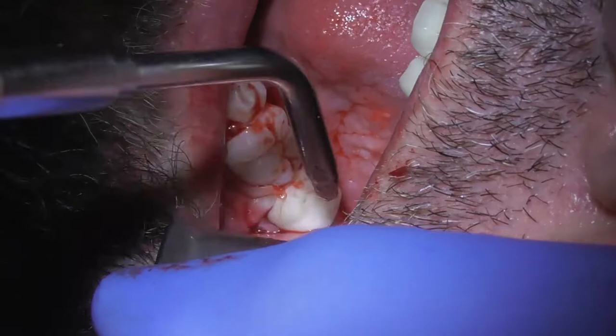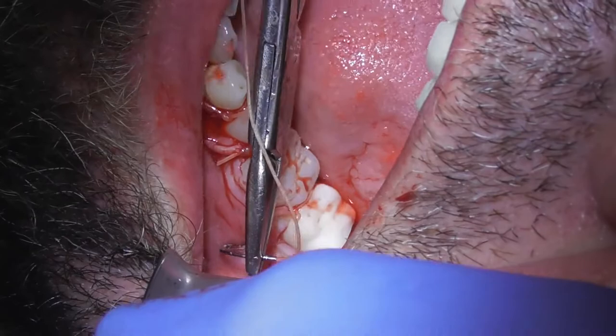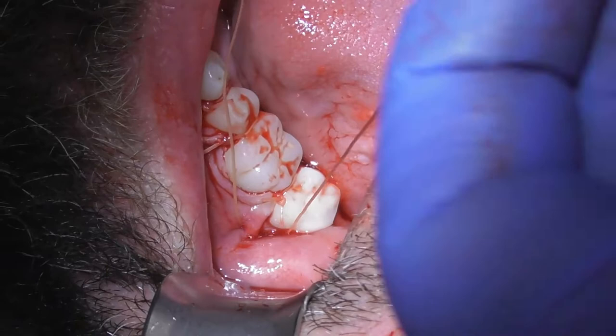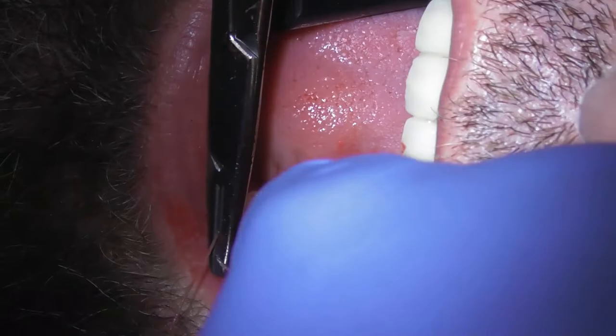I have one more stitch towards the back where I know it's good and numb because you didn't feel anything way back there. Take a nice deep breath — you're holding your breath again. Good job. Let's get this trimmed up. Now we're going to do the ultra long-lasting local, pack it with gauze, and you are done!